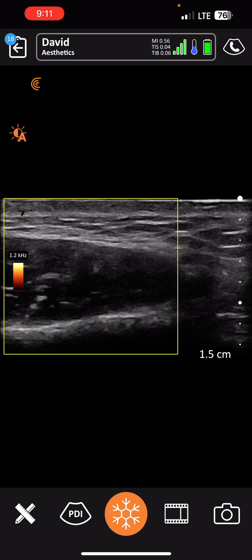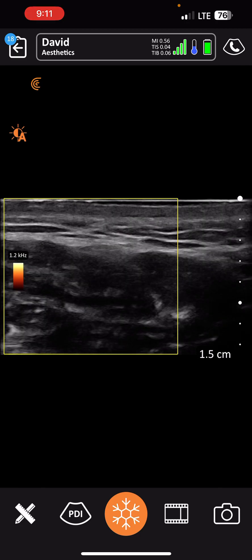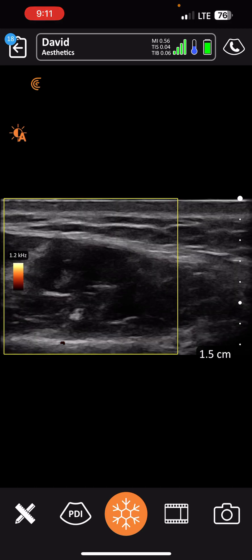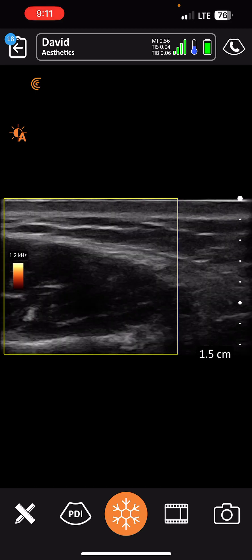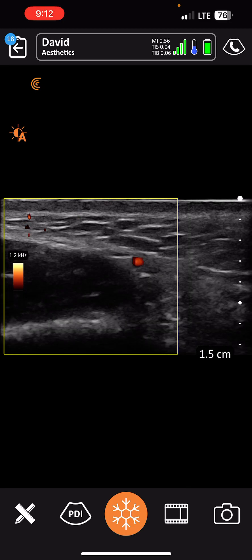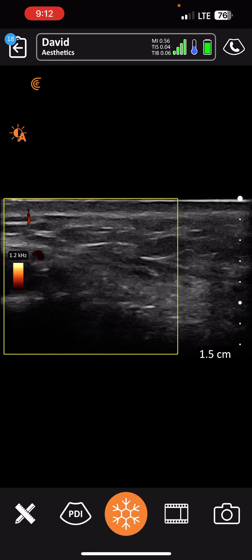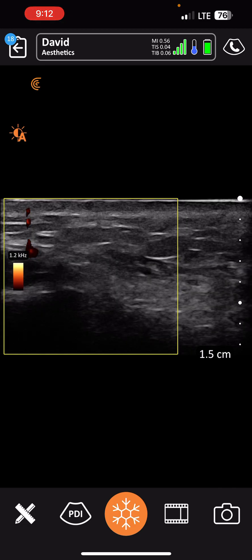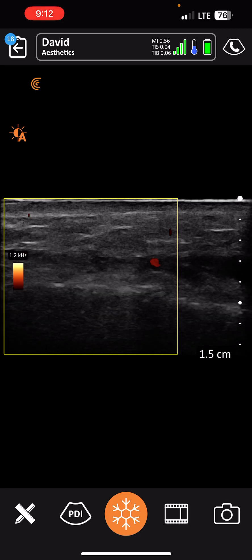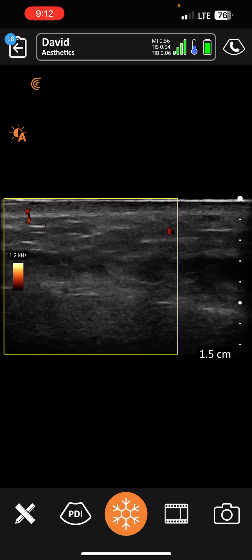I'm looking at the facial artery where it goes in. This is her masseter — the hypoechoic structure, that dark gray. You can see the facial artery and kind of where it's tracking from above, going all the way down. Continuing to track — beautiful. Continuing to track, the facial artery going all the way.